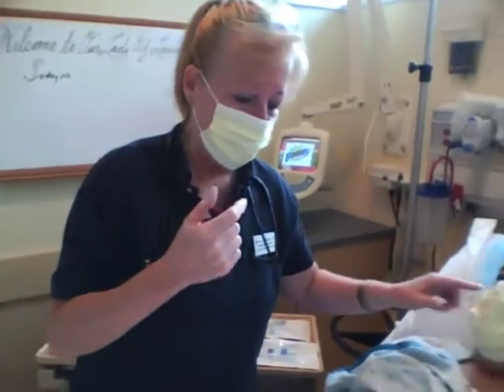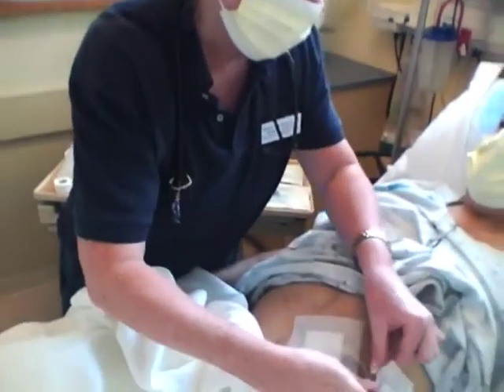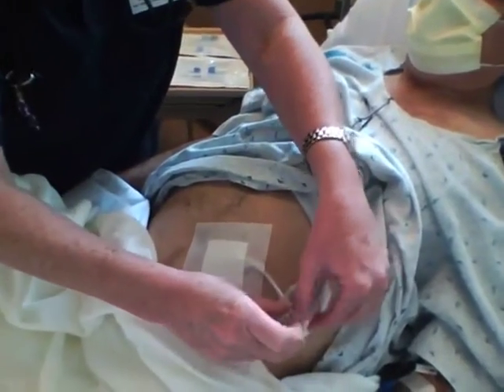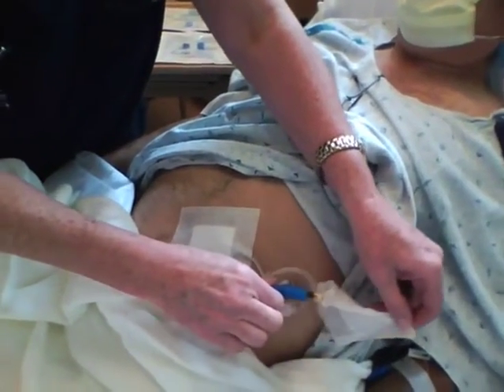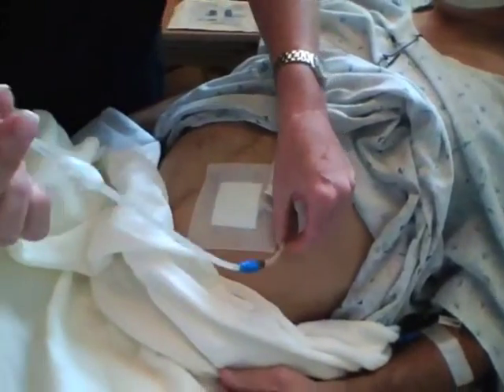Your patient, as well as the nurse, has to have a mask on. And now all I'm doing — this is a clean area, this is not a sterile area — and I'm just exposing the adapter.